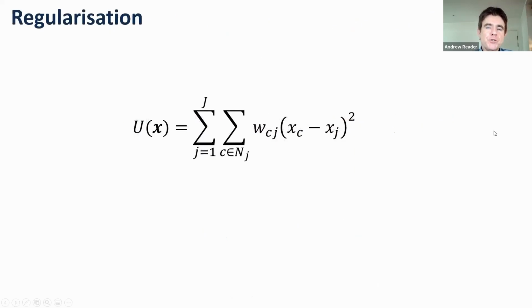So to go more into the regularization then, the problem with that MLEM or OSEM or ordinary Poisson OSEM is that nearly always you need to terminate early to avoid overfitting the noise in the data. If you've got short time scans, it can be very noisy, or low radiation, low injected activity, you can have low counts. And so often we need to regularize.